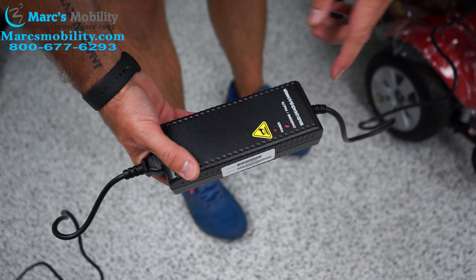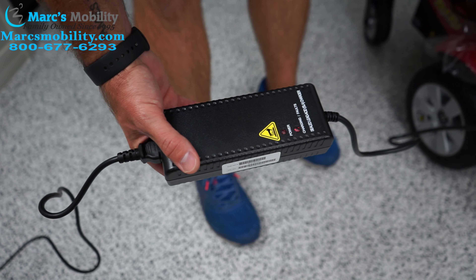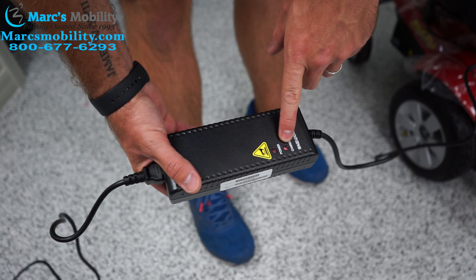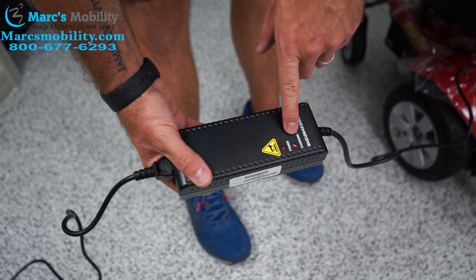How they recommend to charge these chairs is you want to plug the charger into the chair before you plug it into the outlet. You're going to plug it into the chair right underneath the joystick. It only goes in one way, so do not force it — line the pins and slide it right in. Once it is in, then you're going to plug the other end into any 110 outlet.